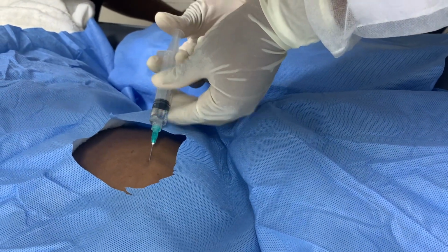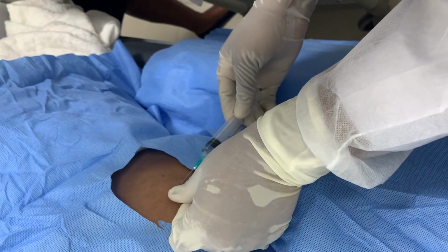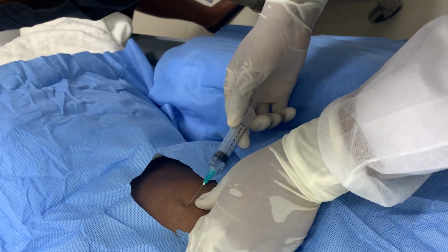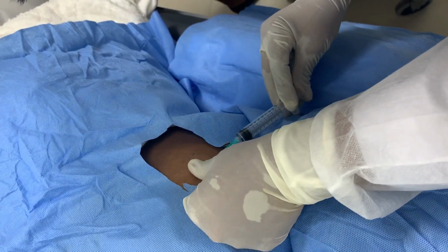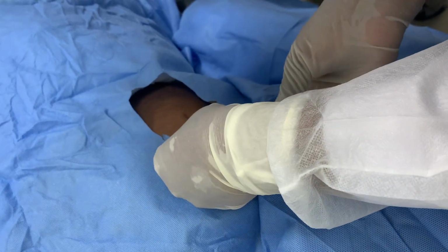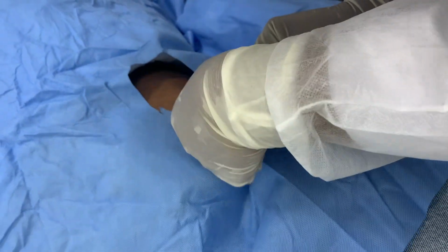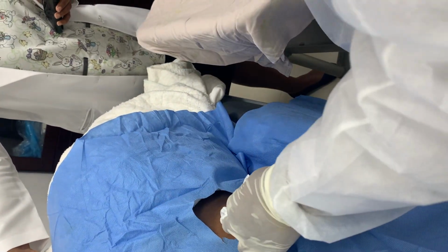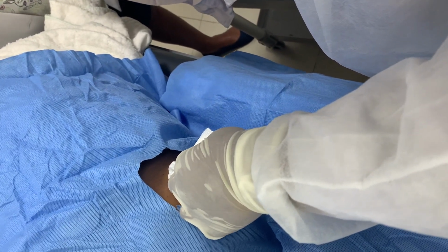So I did the routine things you do when you're about to do any sterile procedure or surgical procedure. I prepped my work table initially, and then I prepped my patient. I got his consent to film this video. I got his consent to do the procedure on him. I explained the risks of the procedure. I did an abdominal exam, just a short abdominal-focused physical exam. I took his blood pressure, I took his vitals, and then I got ready for it.